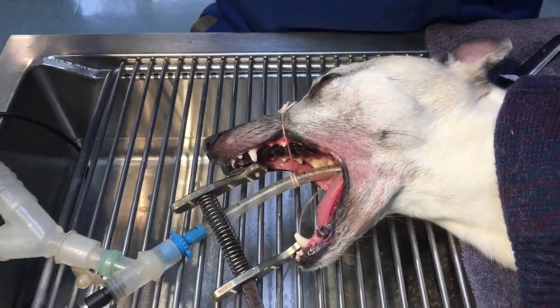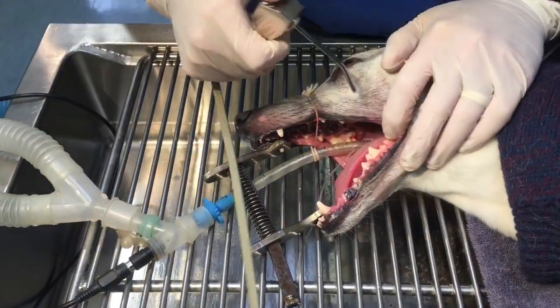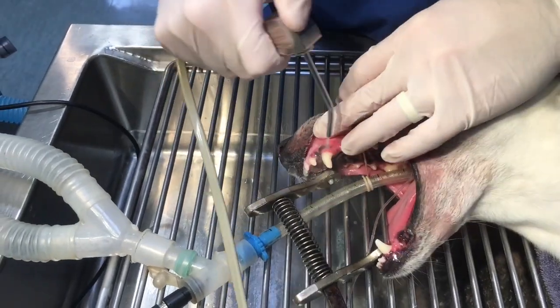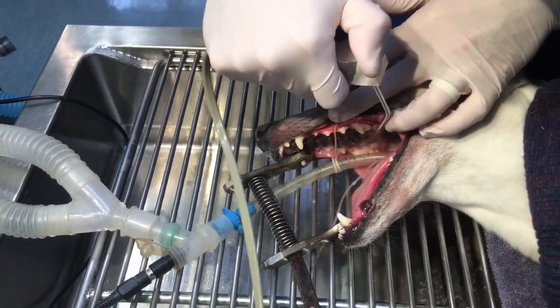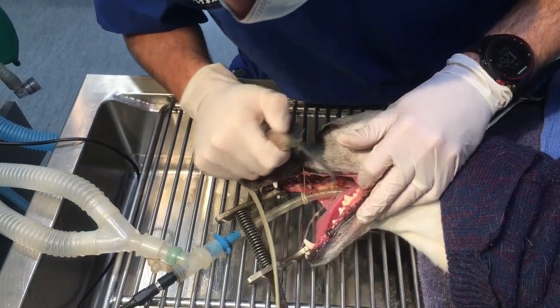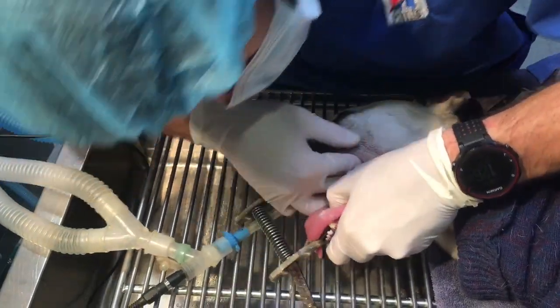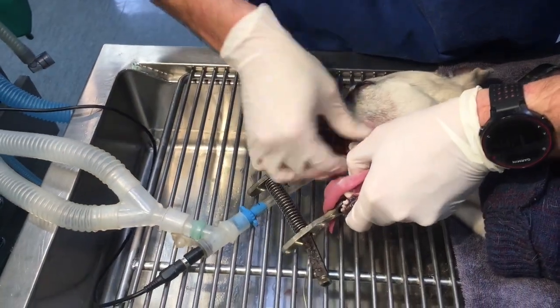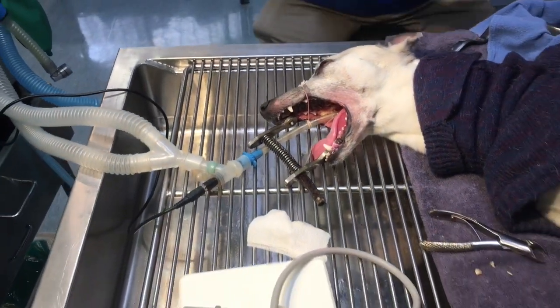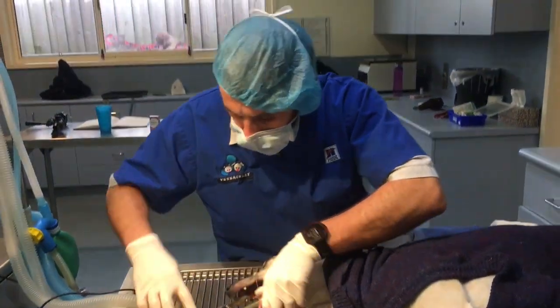Because we can't offer her a cup to rinse and spit, we do it for her. Given that Rosie's a whippet and incredibly skinny and it's a chilly time in the middle of June, we left her coat on to help keep her nice and warm. We pull out our little swab from the back of her throat, flush, put a fresh one in, and then we roll her so that we can do the other side.